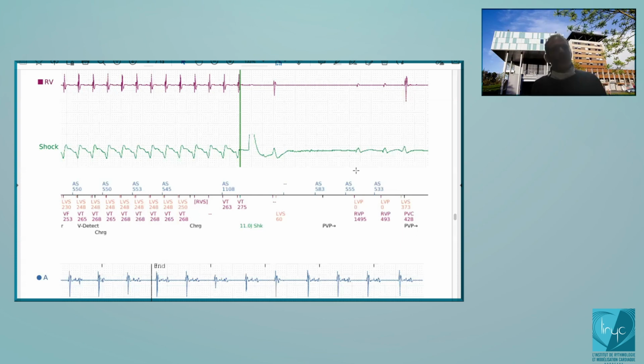During this initial duration, you need to have 6 out of 10. If you want to deliver a shock at the end of the charge of the capacitors, there is a verification for the first shock that is delivered for the episodes, if it is programmed as non-committed. If it is non-committed, there is a divert window of 500 milliseconds, and you will deliver on the second cycle 2 out of 3. If 2 out of 3 are slow, then you will divert the charge.